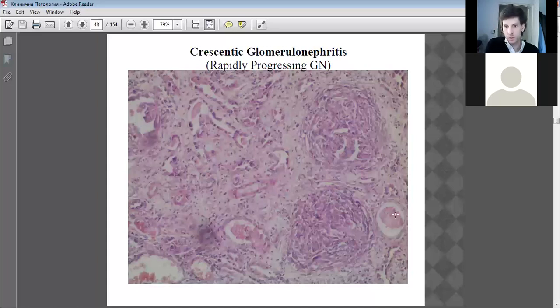We've got an example of blood vessel there. They're fairly normal, but this one is broken down due to the darkening area of necrosis. This is the necrotic tissue there, usually around the spaces that form. So the cells are actually beginning to die in the kidney. Okay, and that's due to the accumulation of toxins because the kidney is unable to filter out or deal with the toxins, if you like.